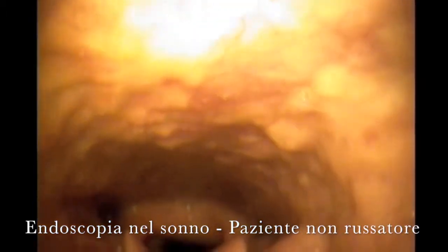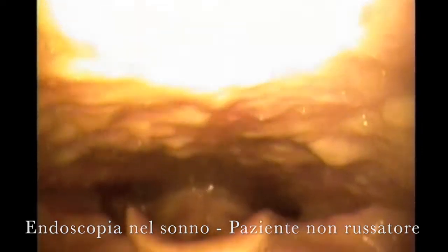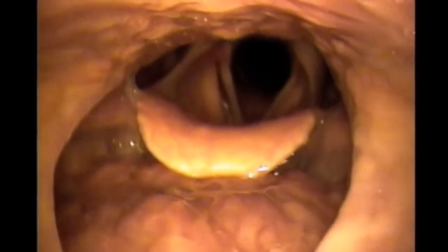The patient is then allowed to wake and more precise counseling can be provided regarding what was snoring and what can be done about each of these areas.